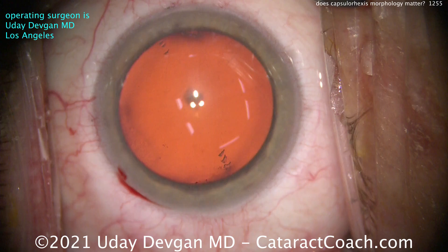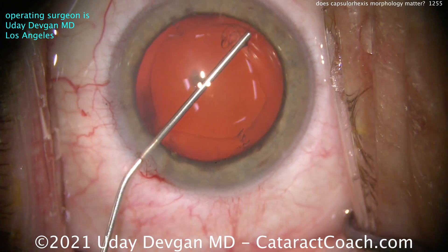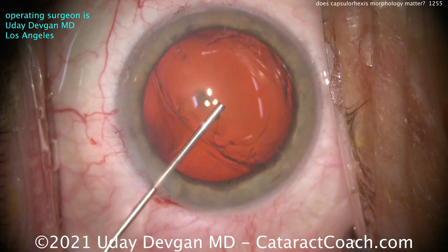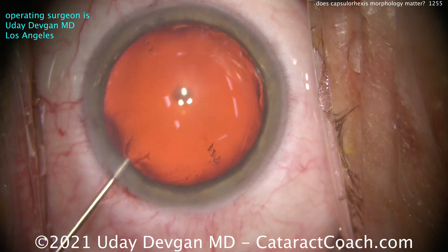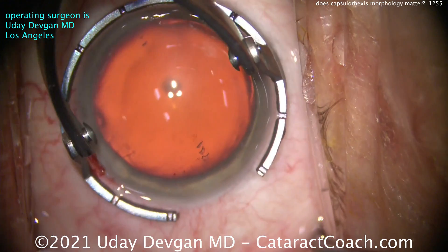So in this case, we're going to do a capsulorrhexis as usual, and it's not going to be a perfect rhexis. Now I'm a perfectionist — I love a perfect rhexis, I love when it looks that pretty. But my question is, does it even matter?